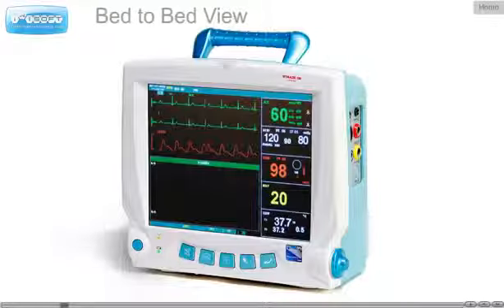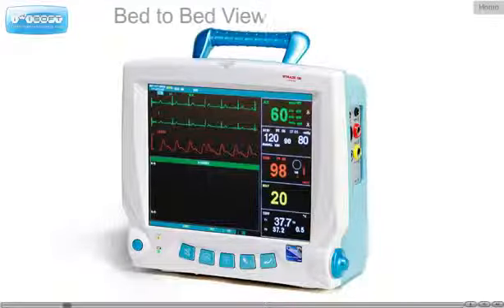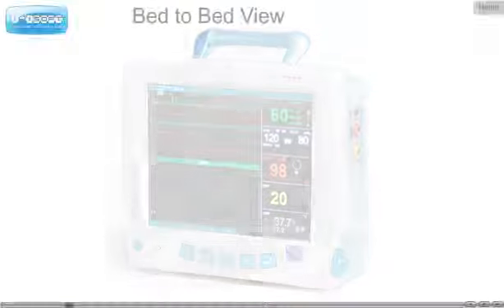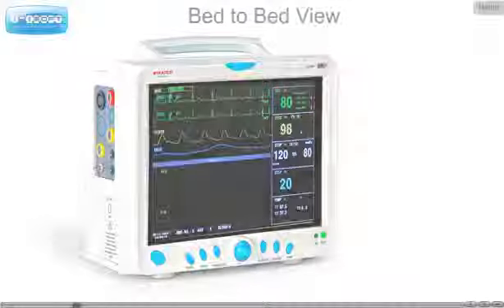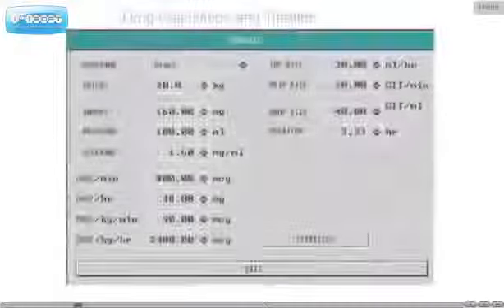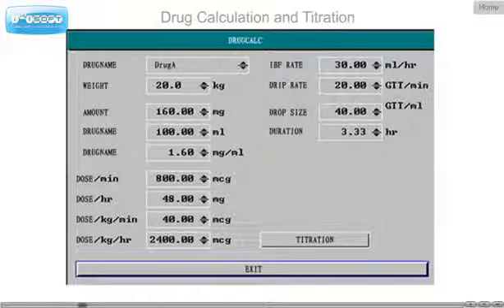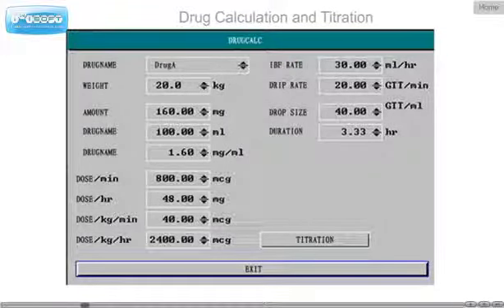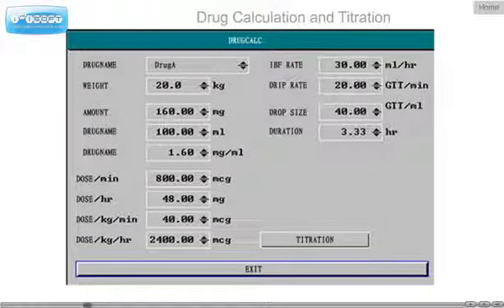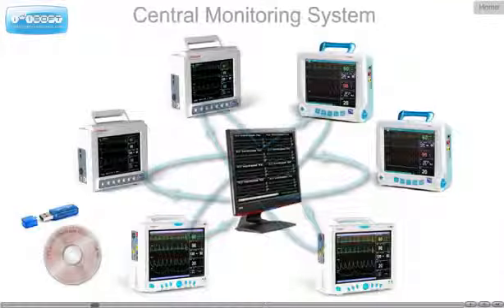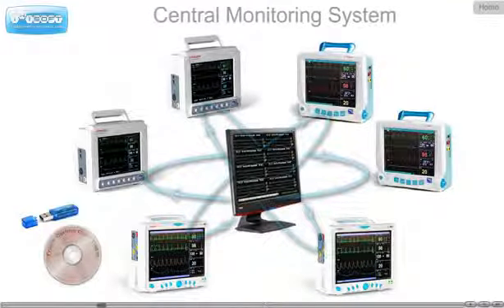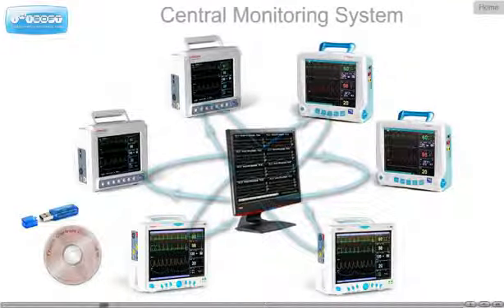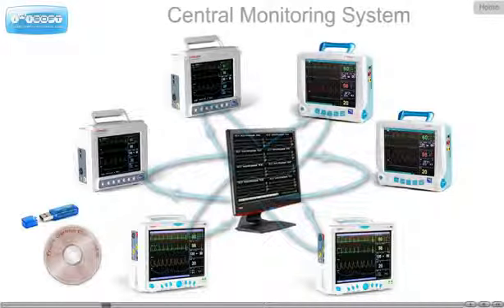Under the central monitoring system, any patient data can be viewed in any bedside monitor. Computation for 15 different drugs as well as a titration list display function is available. We can use the available network of the hospital for installation of Trace Central Monitoring System software.